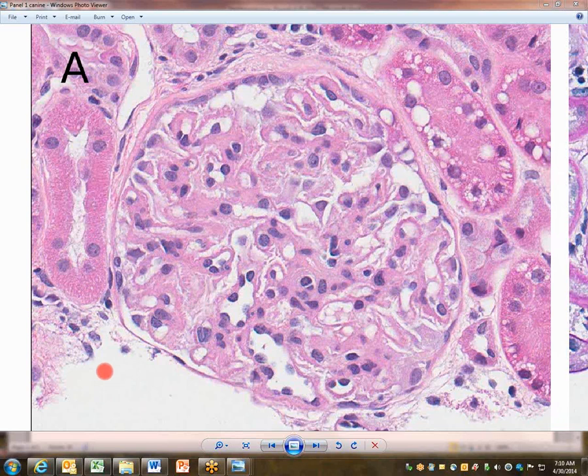Fire away. All right, this is Becca Conkin. I'm the first-year resident at Ohio State, and I'm the only anatomic here, so I'm doing this first panel.